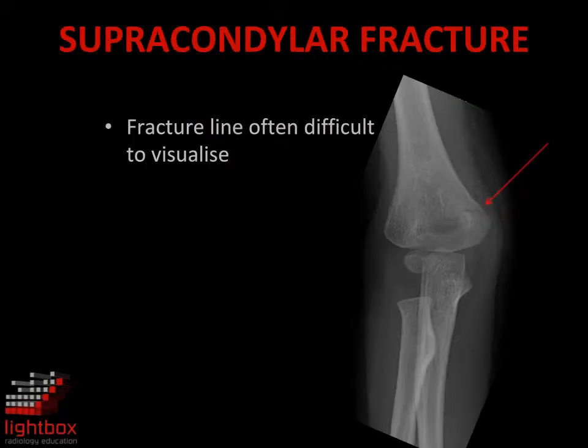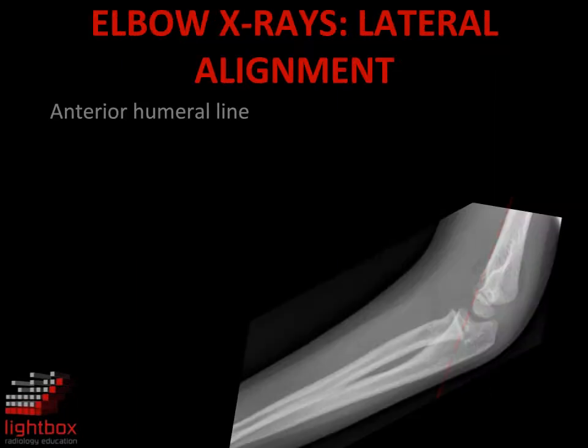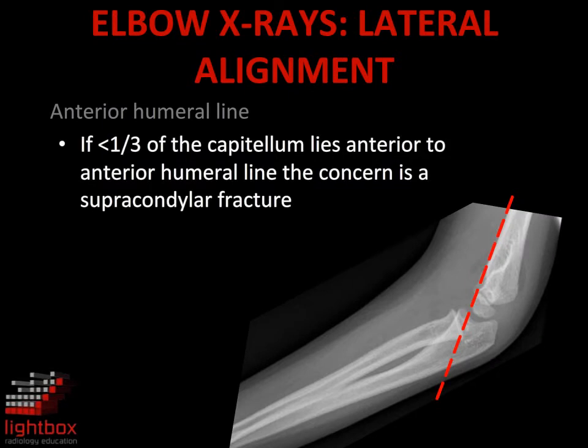Supracondylar fractures of the distal humerus are often difficult to visualise. Loss of the normal alignment, with less than one third of the capitellum anterior to the anterior humeral line, is often an important sign in the diagnosis of a supracondylar fracture with posterior displacement or angulation.